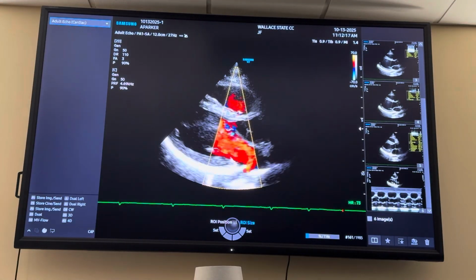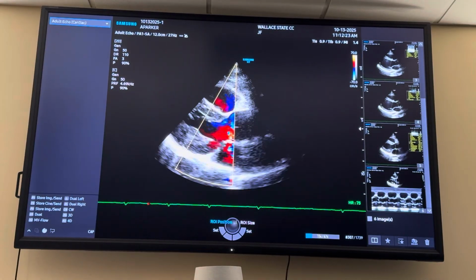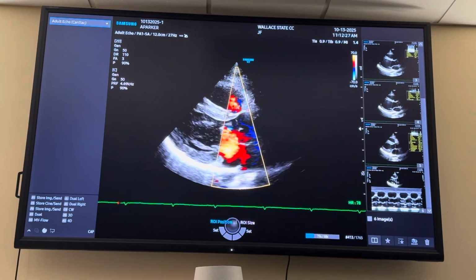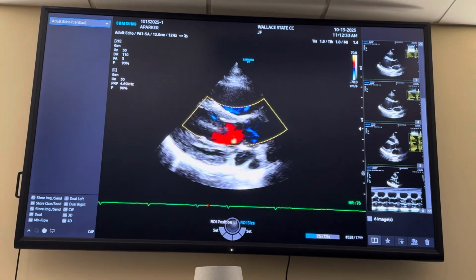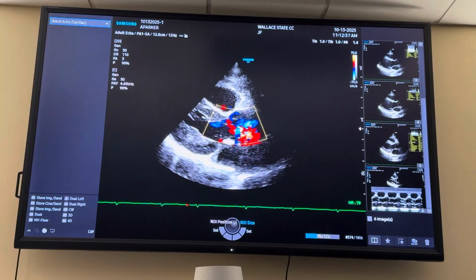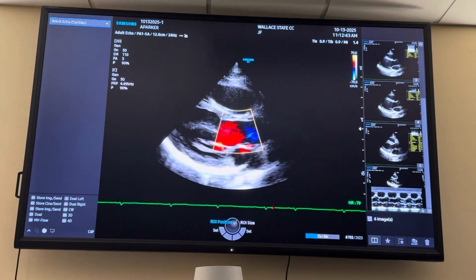Even this, sometimes when you have this, you know, what am I looking at? I think I had a couple of these like that. Just be very mindful of the shape of your box. You want it to know where your focus is. You don't want it too big. You don't want it too wide. I don't want to see this for sure. This is not going to include aortic and interventricular septal wall. That's not going to work because you can kind of tell it takes away from what you're looking at. Kind of slows your color, like your frame rate's down.